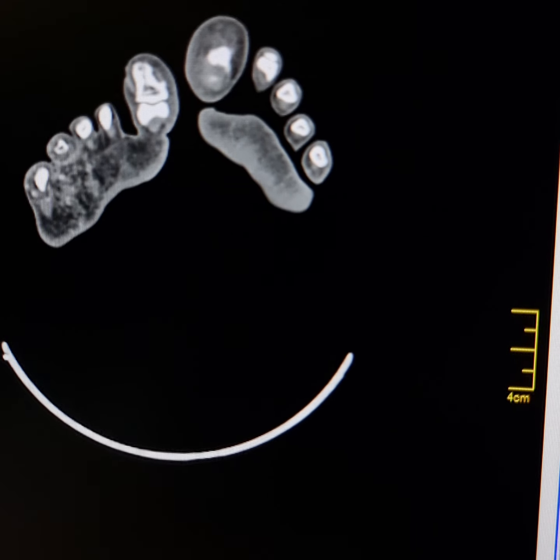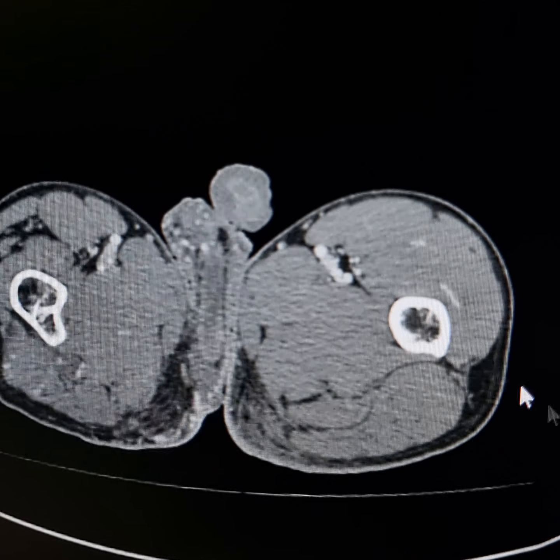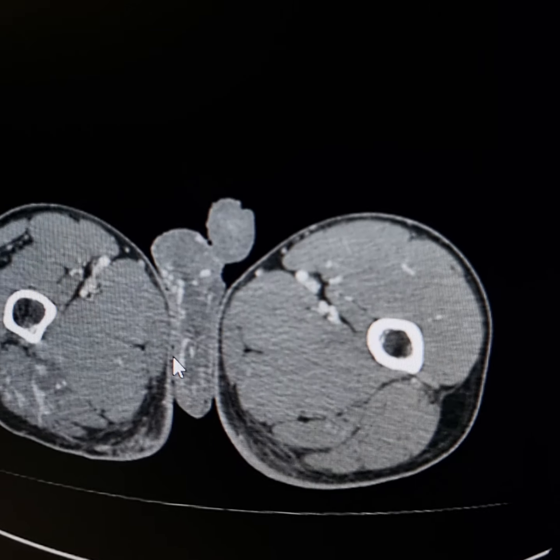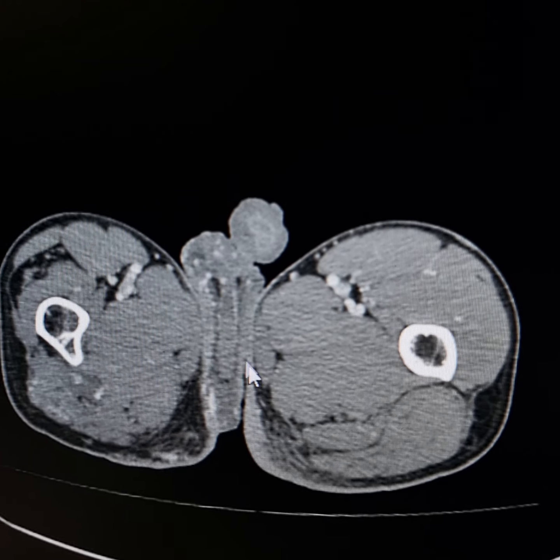Now I scroll it back again to show you its proximal drainage and communications. Now please observe the dilated cremasteric veins. Visibly, the patient had varicose veins along the scrotum.